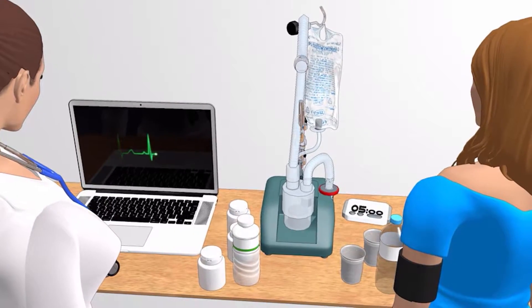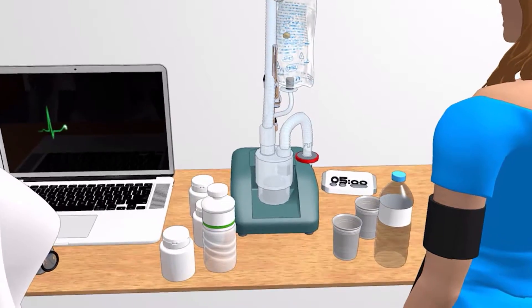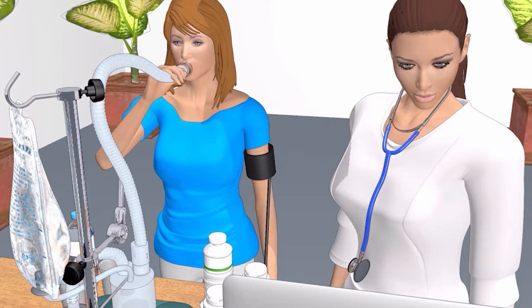We will use a saline induction machine to collect a sputum sample from you. The materials and equipment we will use are saline water, regular bottled water, an induction machine, and a few containers.